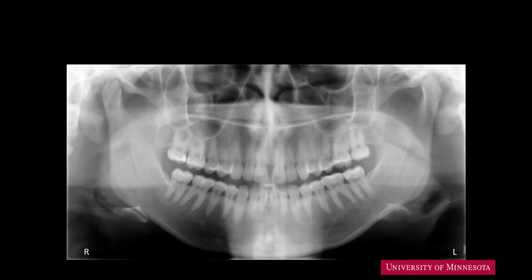As you have learned earlier, a panoramic or pantomographic image is a single tomographic image of both the jaws and their surrounding structures. Because it is a tomographic image, it adequately records only the structures inside the focal trough; structures outside the focal trough or focal plane are usually blurry or not even recorded. If your patient is not properly positioned, some structures may be out of the focal trough, making them blurry or distorted. An ideally recorded panoramic radiograph is also somewhat distorted. Therefore, measurements obtained from a panoramic radiograph are not reliable.